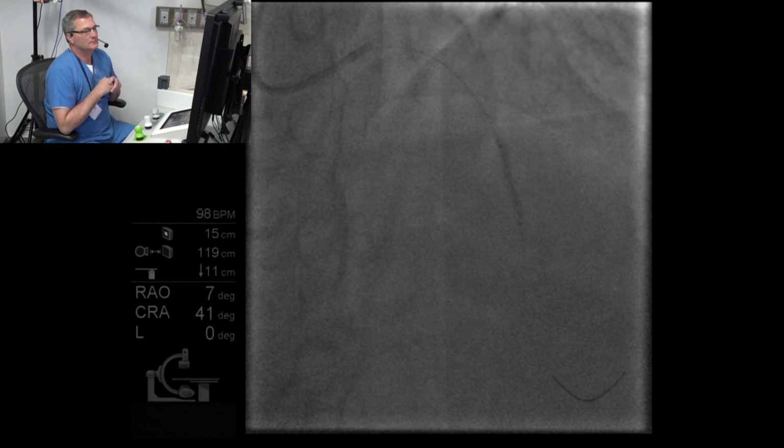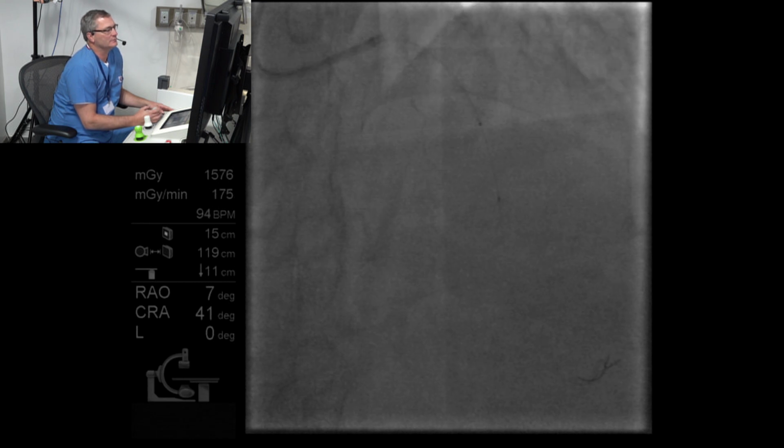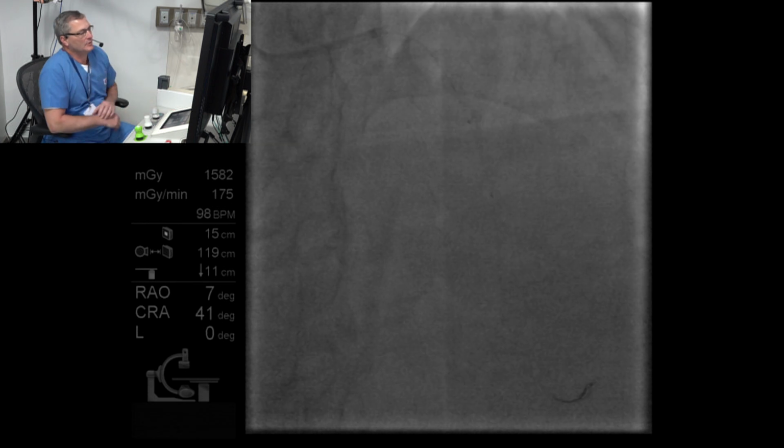Yeah, I'm going to come back just a few millimeters and dilate again. I'm going to try to do this without pushing forward on the balloon so I can wind up with a measurement. Okay, let's go up there and let's go up to 18 atmospheres.